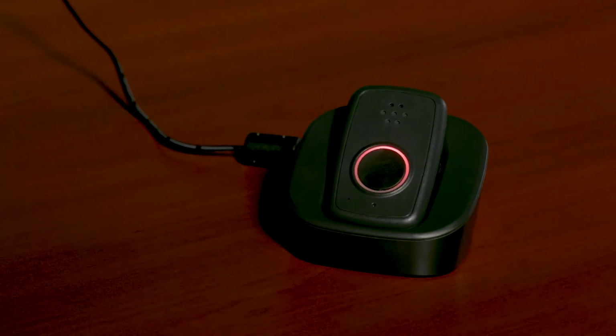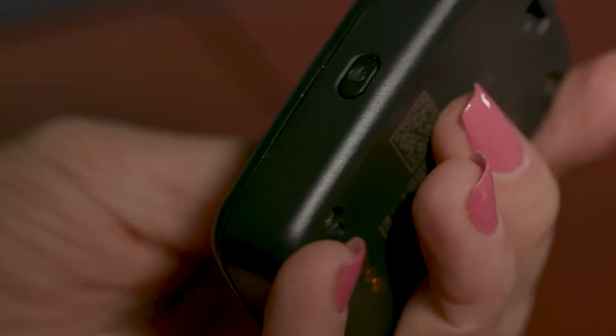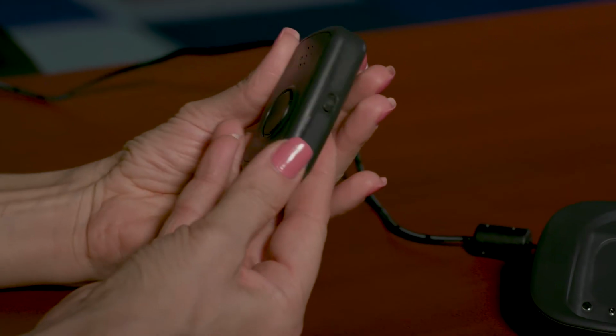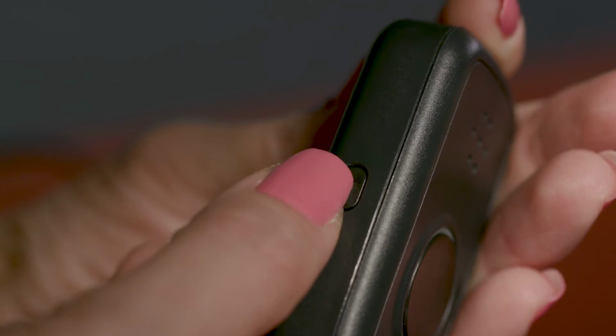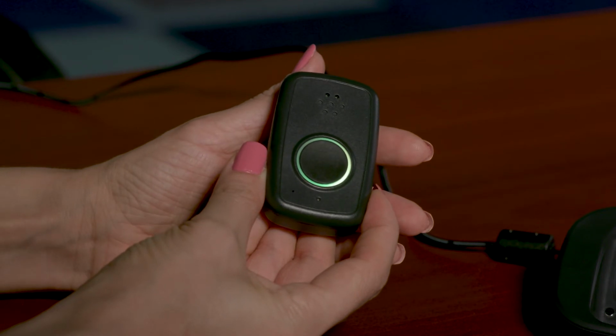To test the micro, remove it from the cradle and make sure that it is on. If your device is not on, you can turn it on manually by pressing and holding the power button on the side. Find the button on the opposite side of the power button marked with the letter T. Press and hold the T button for about 3 seconds until the micro says, "User auto test. Please press your emergency button or pendant."